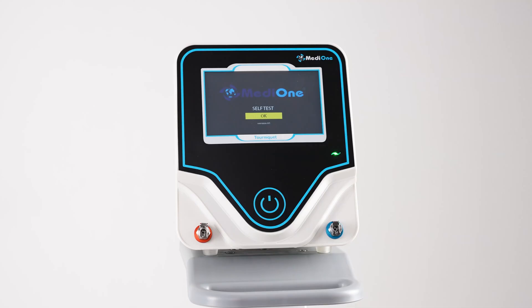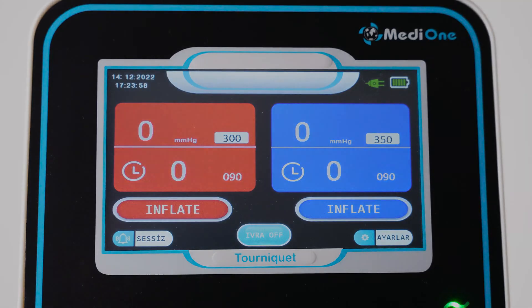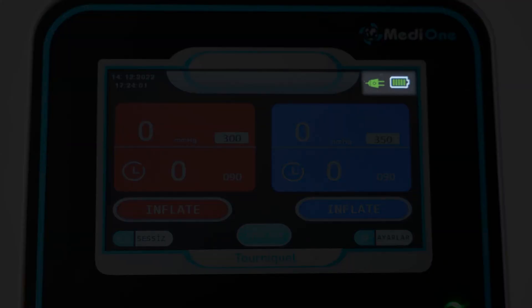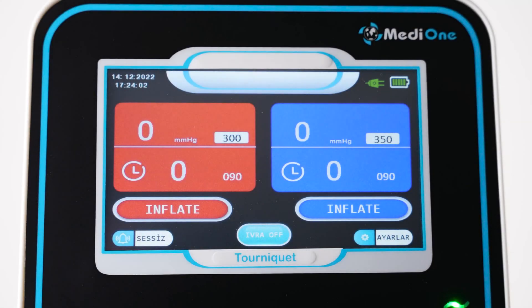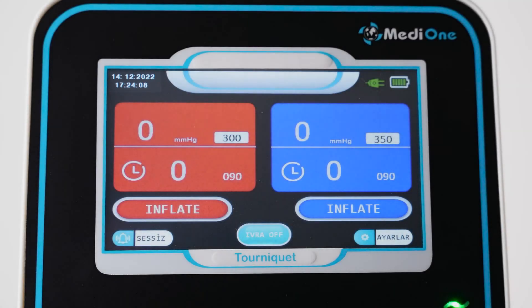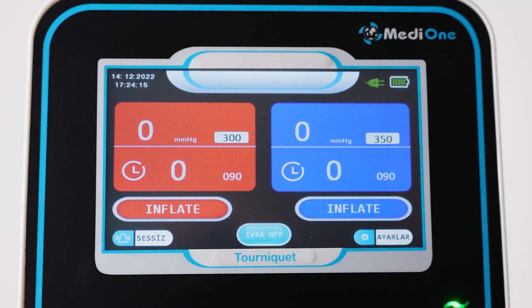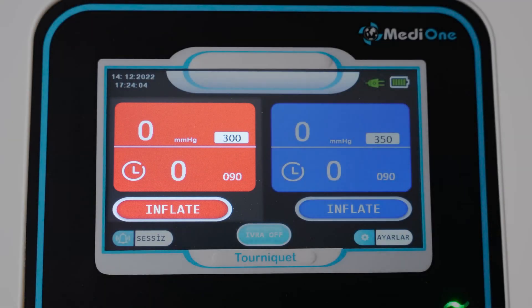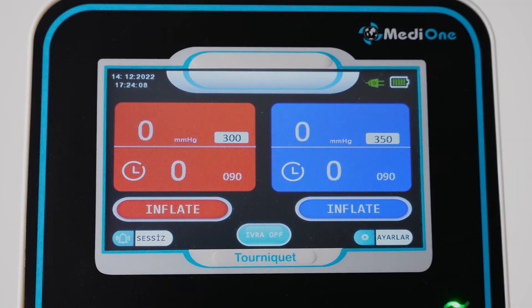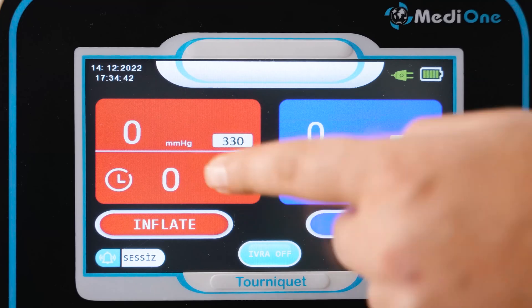Make sure that the hoses are not connected to the device while performing the self-check. At the top right of the screen are the AC and battery indicators. There is a date and time display at the top left of the screen. At the bottom left of the screen is the mute icon to silence alarms. The screen consists of two parts: the proximal part is colored red, and the distal part is colored blue.